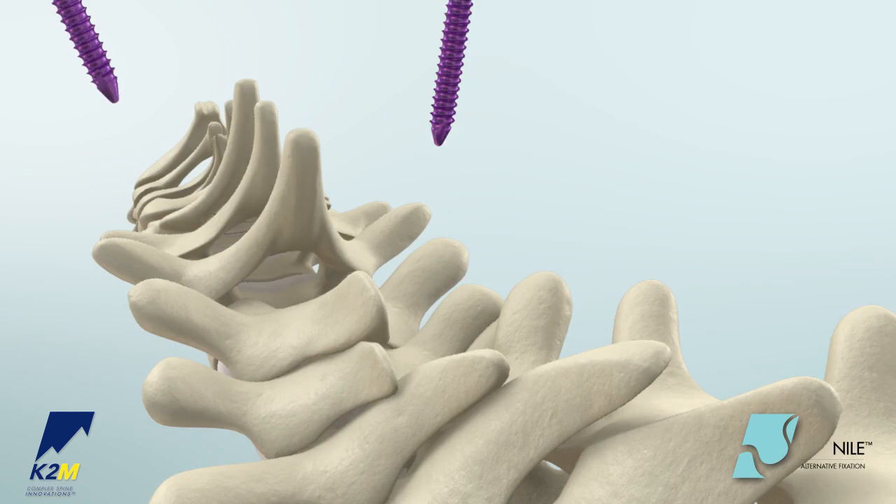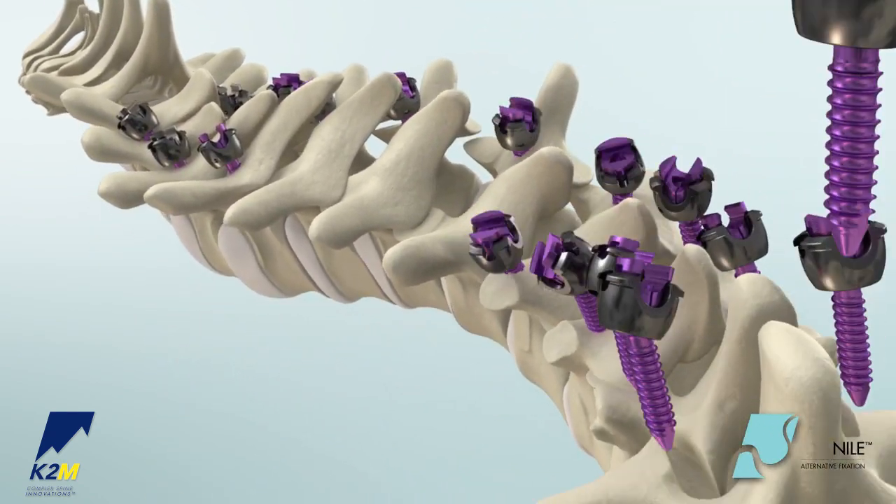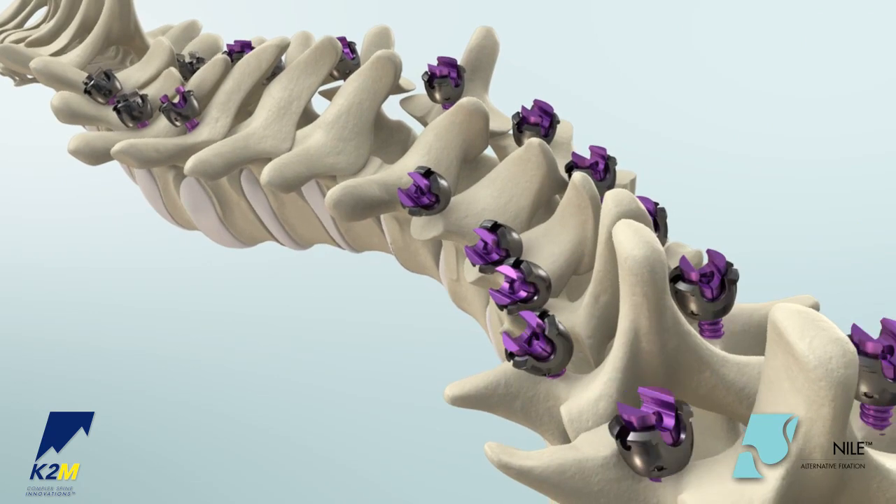An assortment of clamps, hooks, and screws is available with this product. For the purposes of this demonstration, the Mesa Deformity System utilizing a 5.5 mm rod will be shown.